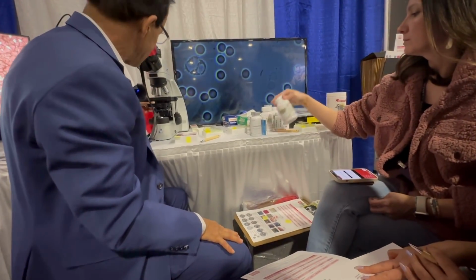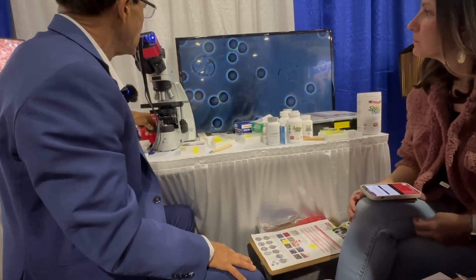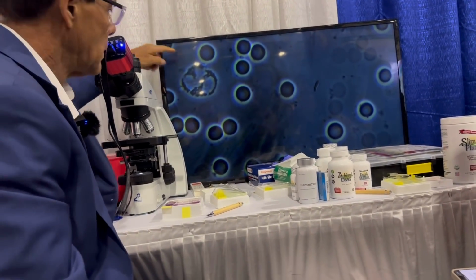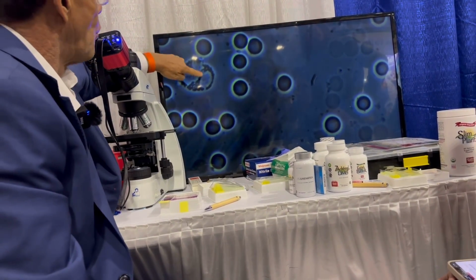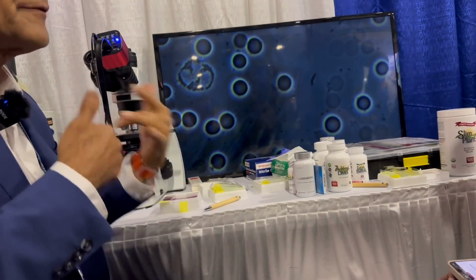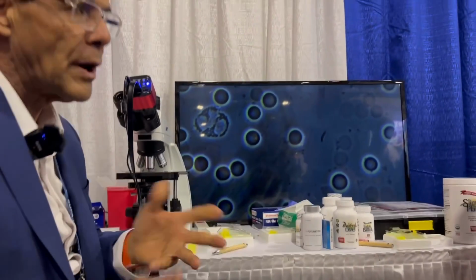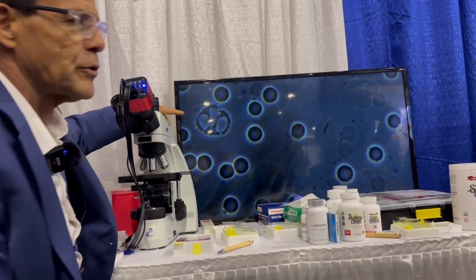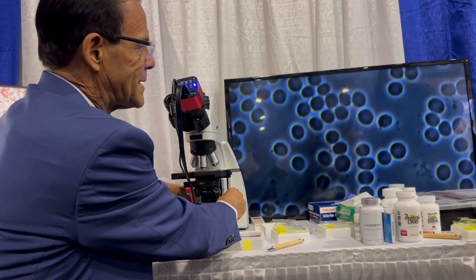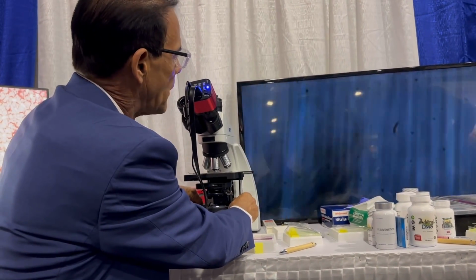And if you can actually see this white blood cell, it looks like it's trying to engulf some candida right there. And you see the lobes, 1, 2, 3, there's 3 lobes. If you have 5 or more lobes, it's a definitive sign of B12 deficiency. You have 3, so we're not worried. But also there should be only 1 white blood cell for every 500 red blood cells. So far she's got 1 per around 50.